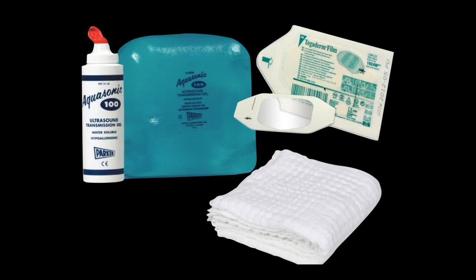So I tend to ultrasound patients without a Tegaderm over their eye, but the idea is that you can put the Tegaderm right onto their closed eyelid and then put the gel on top. I find that you get some air bubbles in there and it makes the image a little less clear, but I tend to give the patient the option to see if they'd rather wear it. Some of them want to wear it, some of them don't.